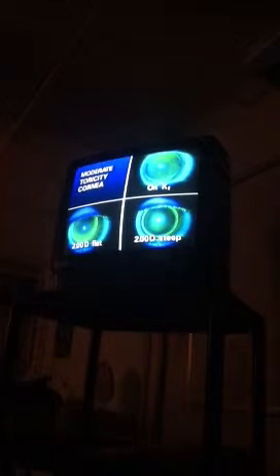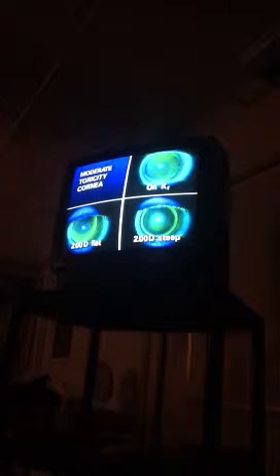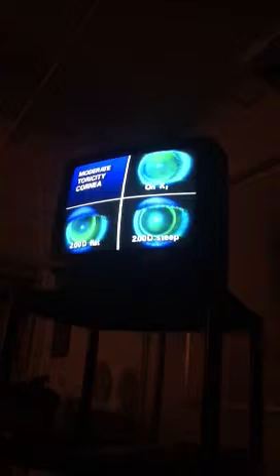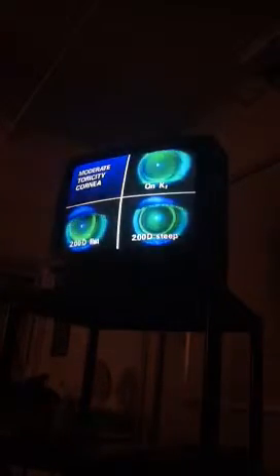On a moderately astigmatic cornea, comparing spherical lenses fit 2 diopters flat on K and 2 diopters steeper than K helps to bring out the distinct fluorescein pattern differences between each lens, say a steep fit, a flat fit.